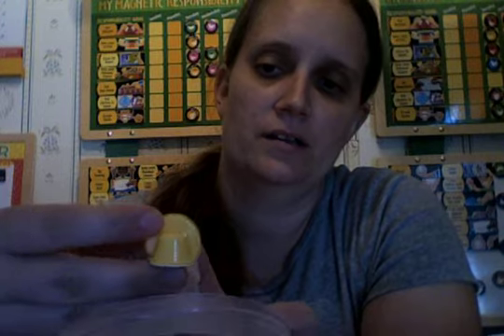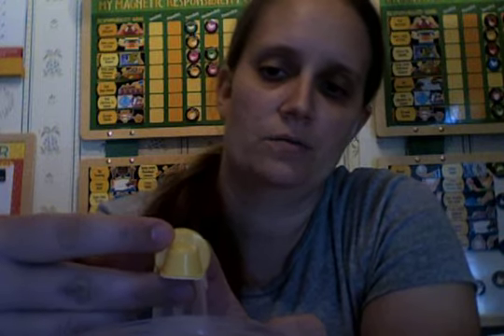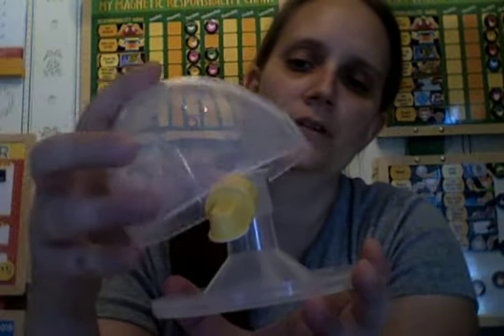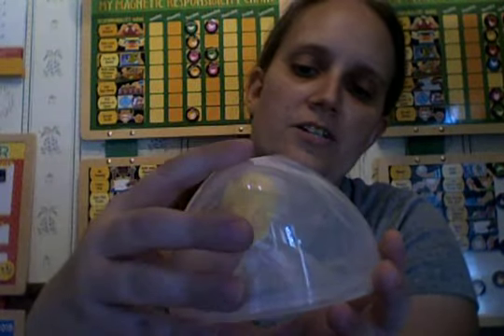They're easier to clean. You don't have to replace them as often. If you get into a bind and you need one, you can use one of these. They work exactly the same. When you put it on, do the same thing. You want it to go with the white valve pointing straight down. That way when you put your shield back on, nothing touches anything. That's really, really important that nothing touches.